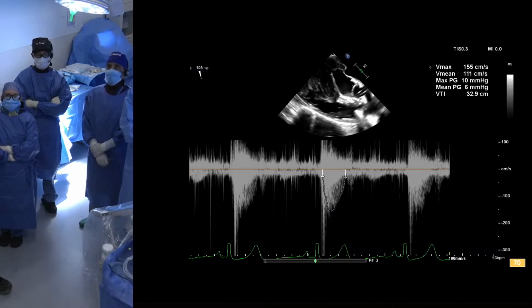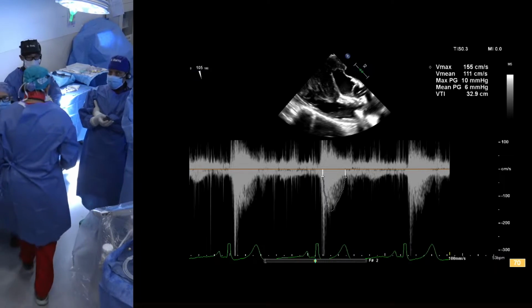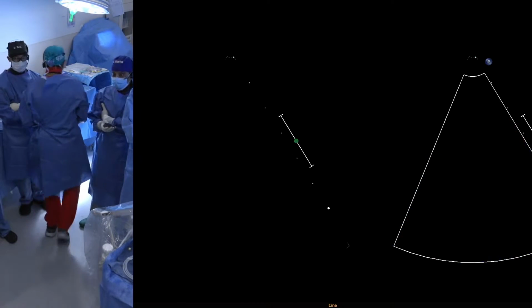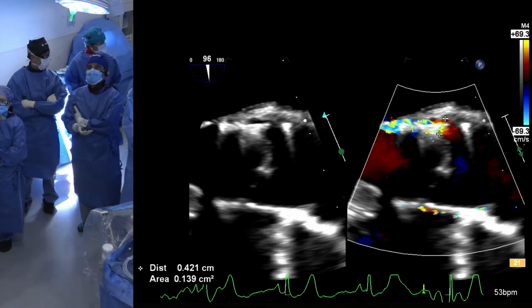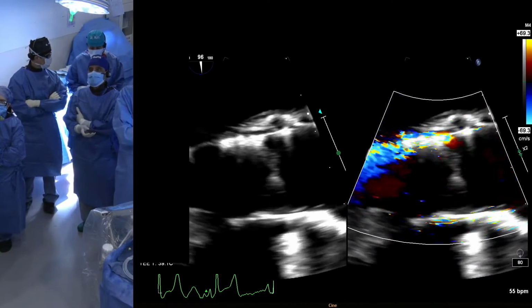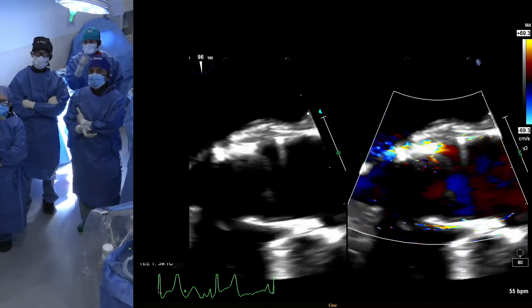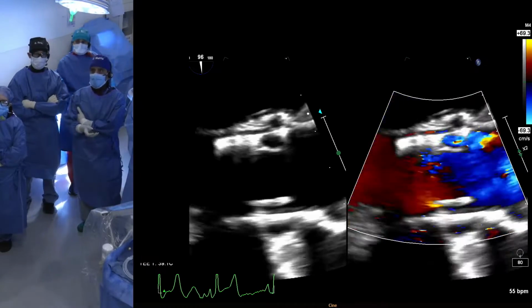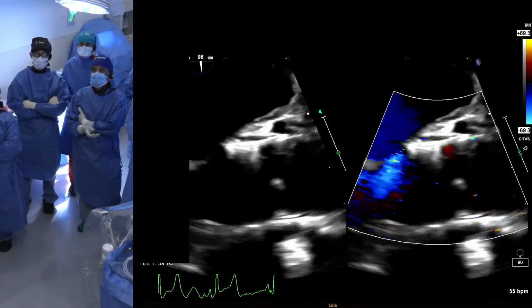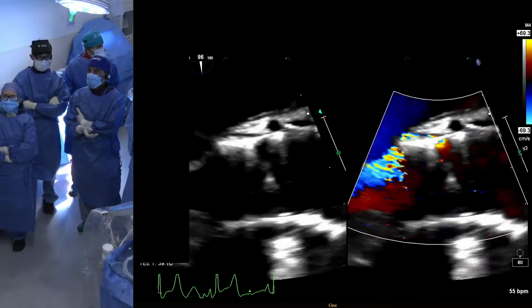Thank you. Okay, so let's go back to the TEE. You mentioned the frame. Remember, the frame is not well expanded at the level of the left main. Go back there. I know you mentioned the LVOT was bigger and the valve was smaller, that is further down, but see where the paravalvular leak starts, just at the top of the frame. So just by balloon expansion, right? Yeah, we may obliterate that.